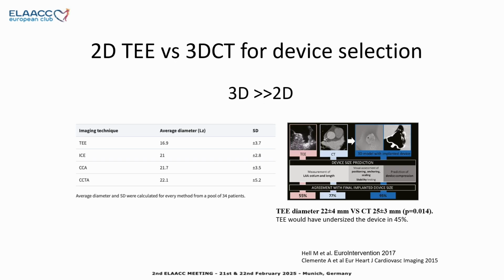And there is an abundant literature on the comparison between 2D TEE and the 3D techniques. All the papers published in the literature have shown the superiority of 3D regarding the evaluation of the maximum diameter of the landing zone. These papers underline the risk of underestimation of this diameter and undersizing of the device. Because we all promote the technique, we must all look for the perfect sizing for the perfect implantation.